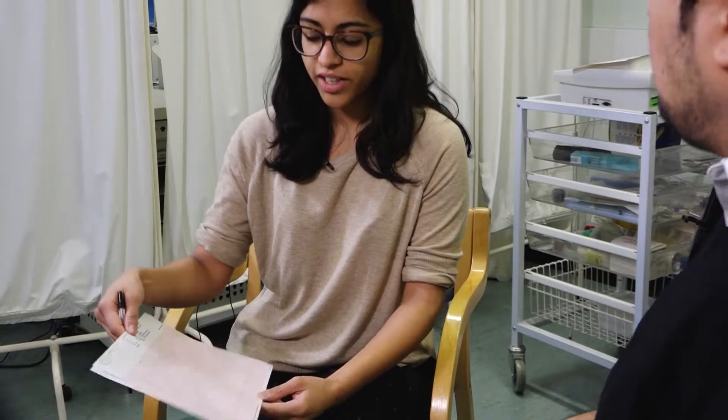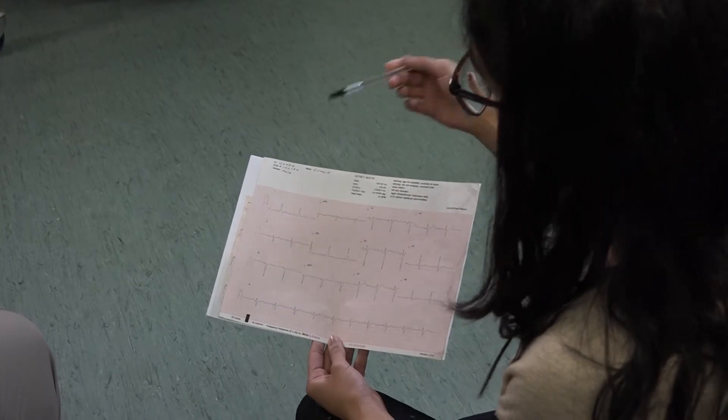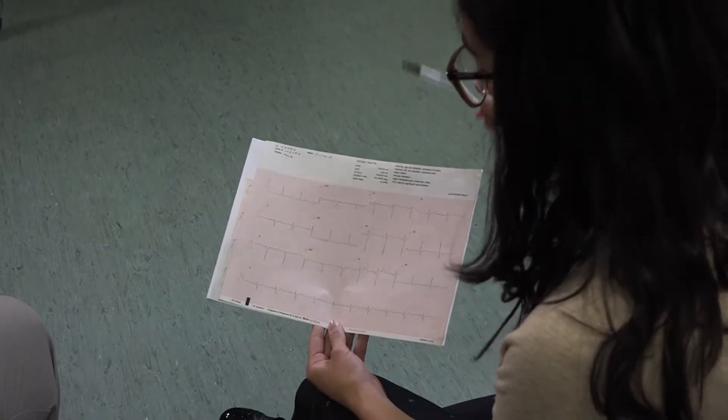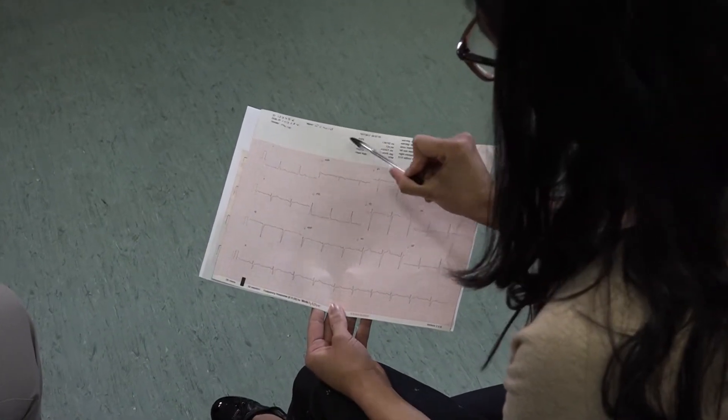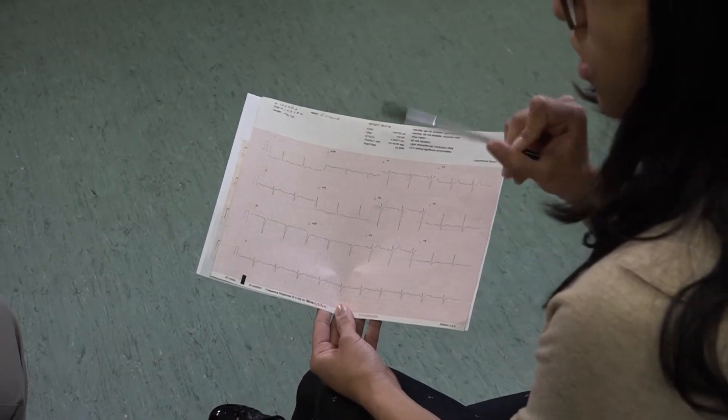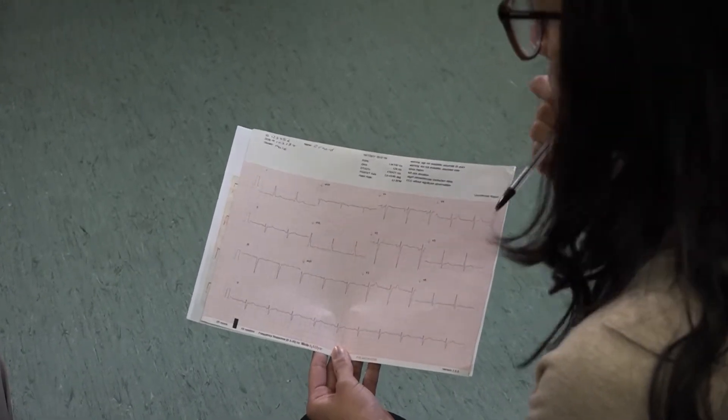First thing you want to check is whether your ECG is from the patient you've taken it from. You do that by confirming their name on the top and double checking their ID, date of birth, and gender. You also want to make sure that the date of the ECG is correct and it's the relevant one you want to interpret.